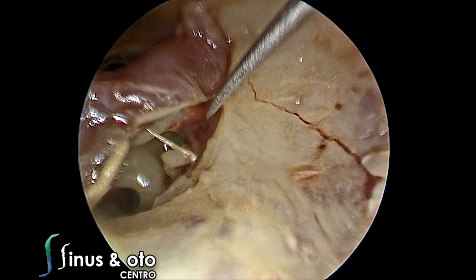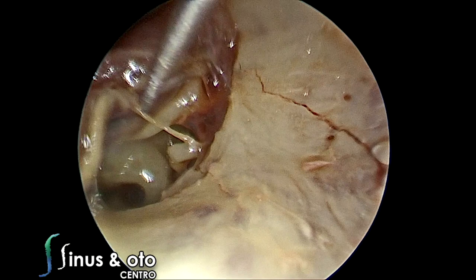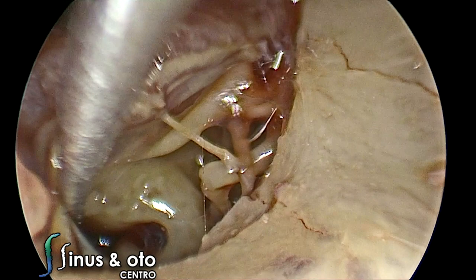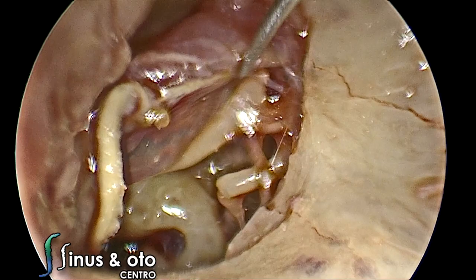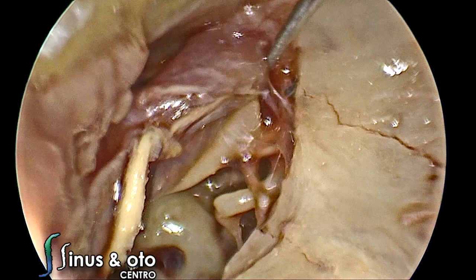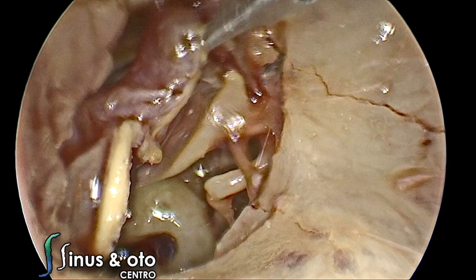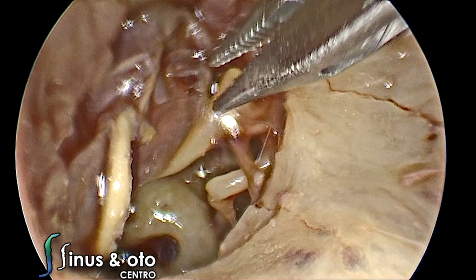The posterior malleolar ligament makes like an X with the chorda tympani nerve. We can then elevate and expose better the long process of the incus. Now we see the chorda tympani, the malleus, the long process of the incus, the stapes, and the round window niche. We elevate the tympanic membrane until we see the Prussak's space opening. With an alligator forceps, we can pull this tympanomeatal flap and expose the malleus.